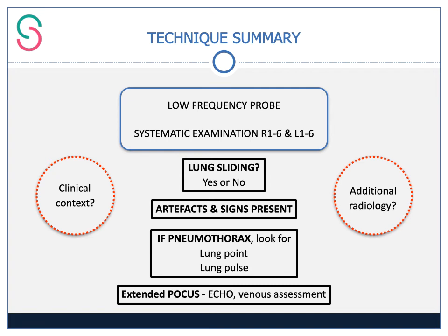All of your ultrasound impressions need to be contained within a clinical context and a clinical question. And if you have additional imaging, such as a chest x-ray or a CT scan, you must also try and use that and incorporate that information.